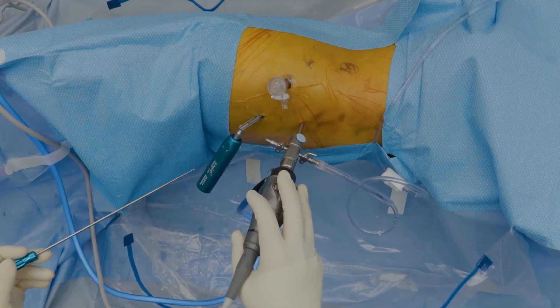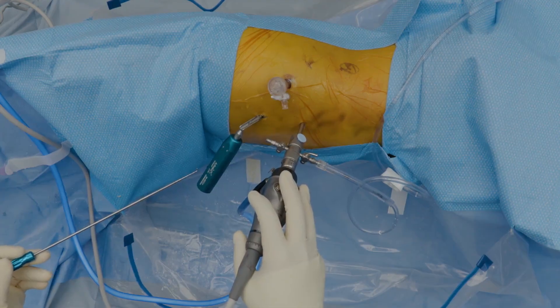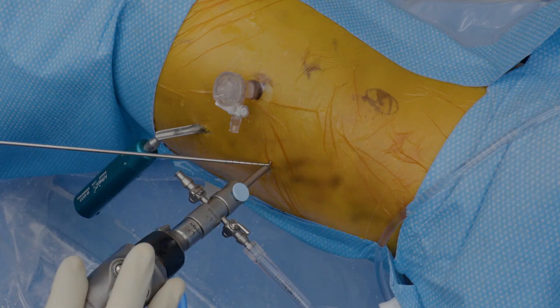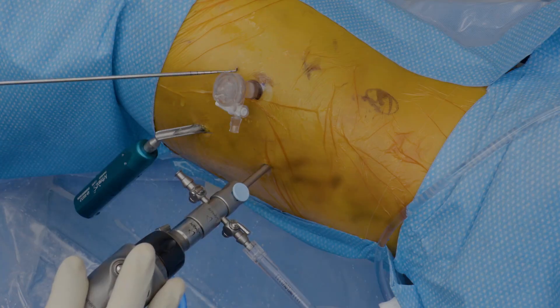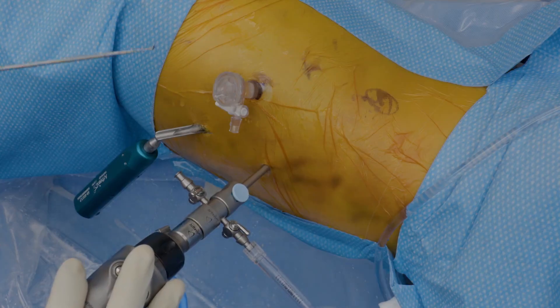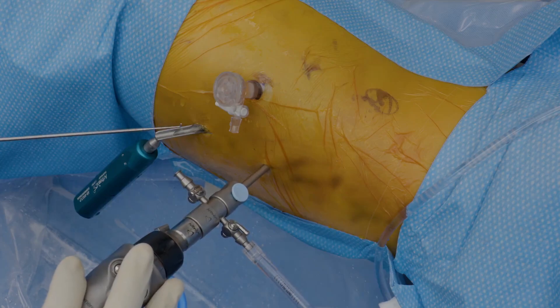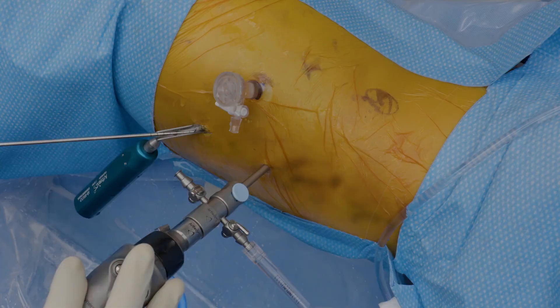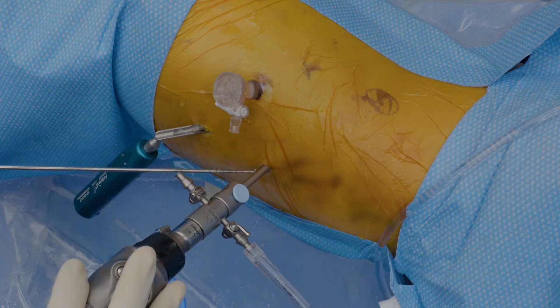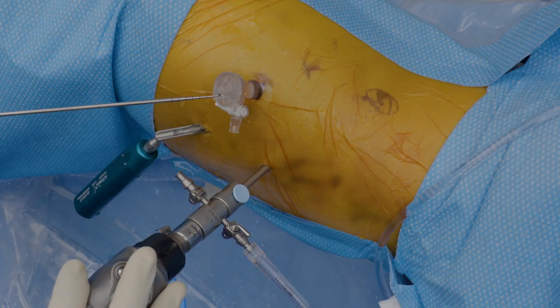Here we have our left hip specimen. Setup is typical for a femoroacetabular impingement case. The most typical portals to review: this is our standard anterolateral portal placed here, and this is our mid-anterior portal placed here. It's often useful for these surgeries, either for anchor placement or for management of cartilage defects or both, to consider placing a distal anterolateral portal. This allows for views from both the mid-anterior and anterolateral portal and instrumentation from both the distal anterolateral and the mid-anterior portal.